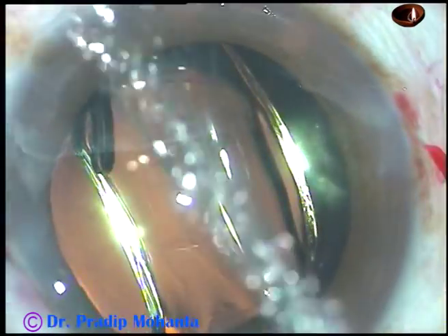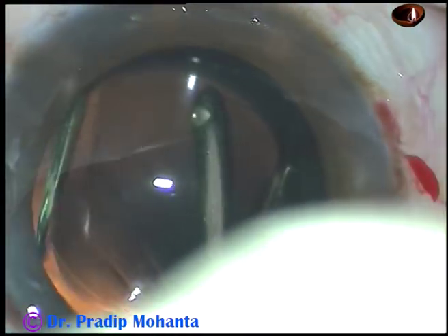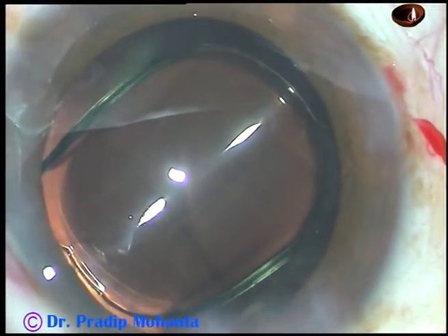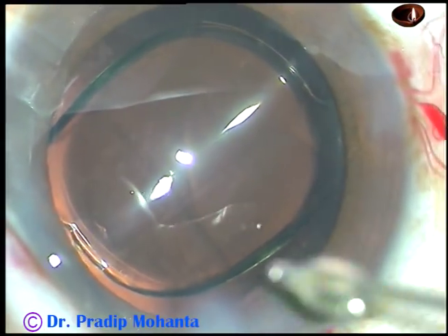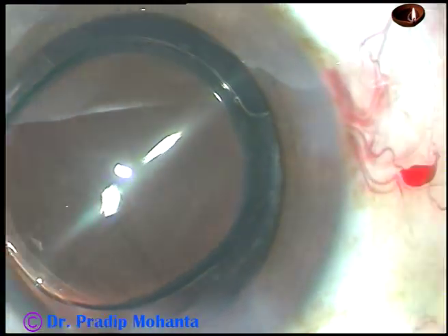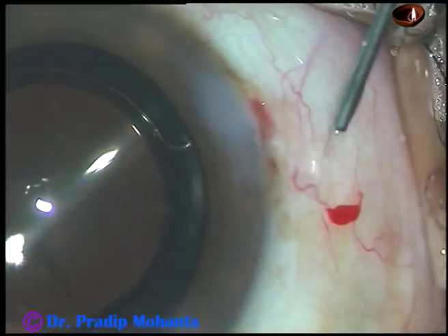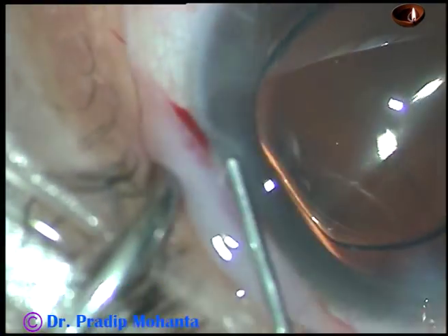And the irrigating probe places the trailing haptic into the capsular bag. The lens is dialed by the irrigating probe, and now the side ports. This is a bit of moxifloxacin, and now the side ports, that is the paracentesis openings, are closed by stromal hydration. The stroma on either side of these stab wounds are hydrated.